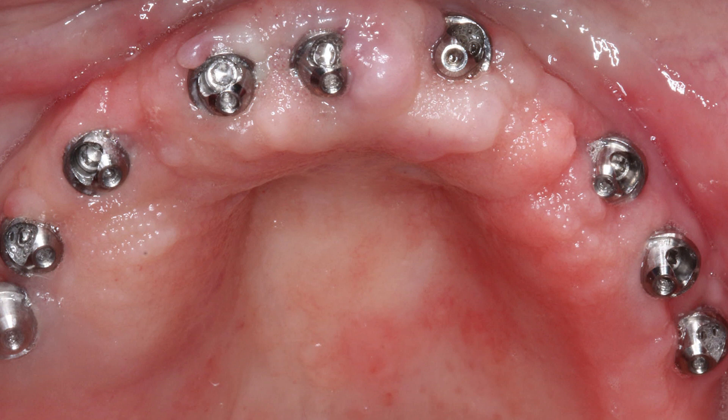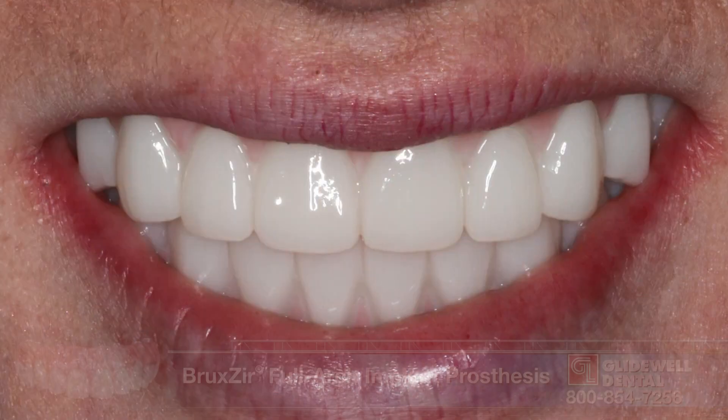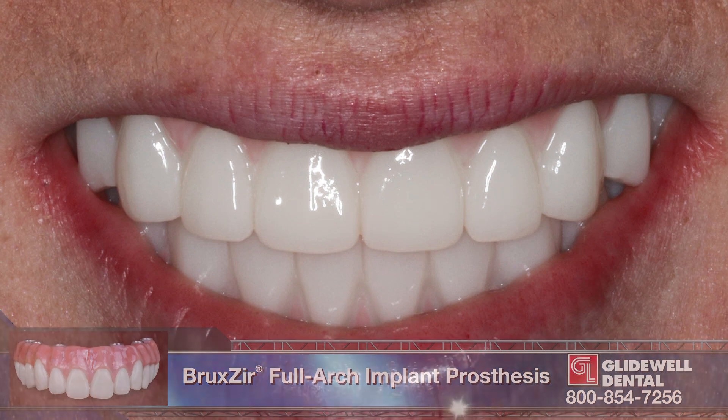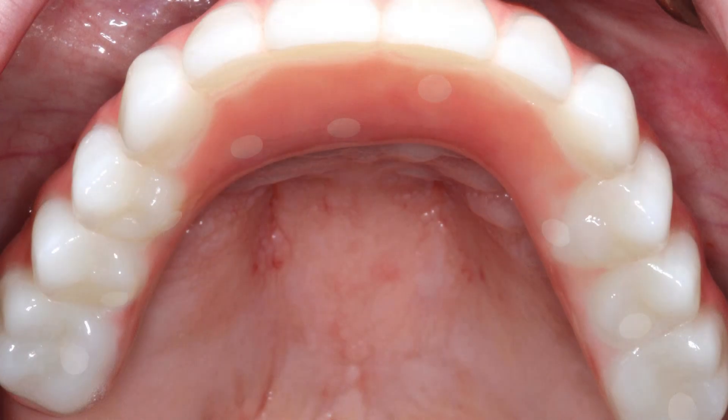At the wax setup appointment for the Bruxer full-arch implant prosthesis, a combination of angled and straight multi-unit abutments were attached to the implants. The angled multi-unit abutments help keep the screw access holes behind the incisal edges and correct for divergent angulation between the implants. The cuff heights of the transmucosal abutments help create a level restorative platform. The full Bruxer full-arch implant restoration was delivered with relative ease, and the multi-unit abutments helped facilitate smooth, efficient appointments throughout the restorative phase of treatment.